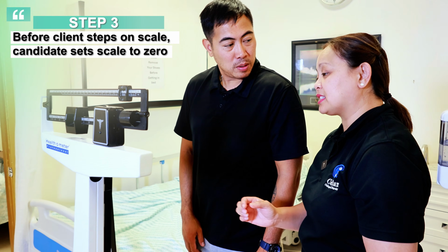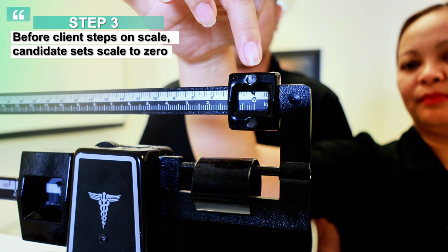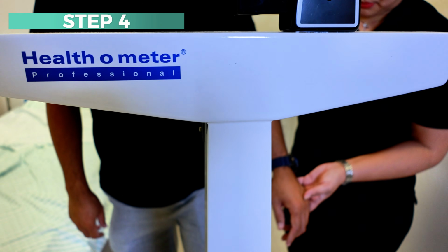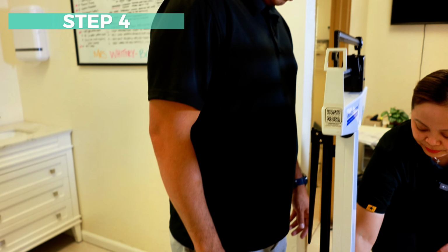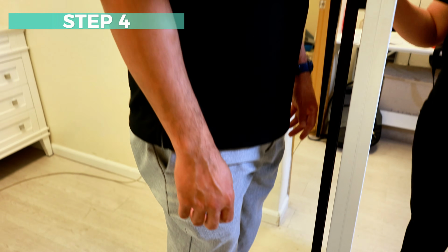Before you step onto the scale, I'm going to make sure that this is at 0 and then 0 and 0. Right? Okay. And then it's balanced. Okay. Now it's a 0, so we're going to have you step onto the scale and then make sure that he's in the center of that scale. Okay, very good. Okay, and then I'm going to begin to measure you.